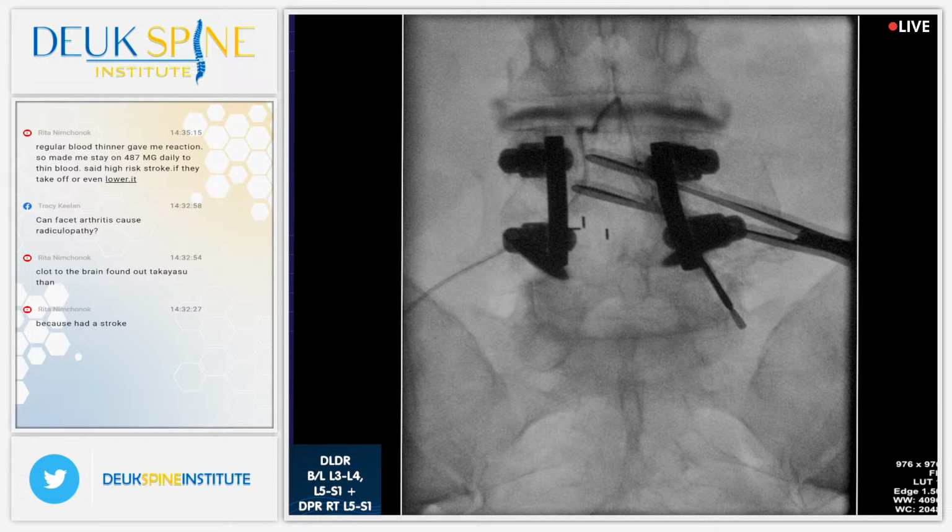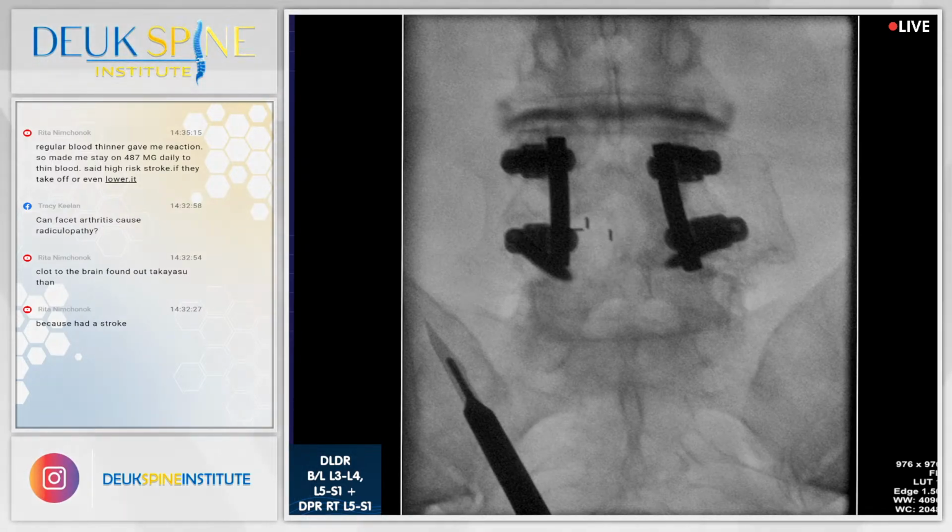So if I can get my probe right there, we can kill the pain nerve. It doesn't matter where you come from, what continent, what sex you are. Shot. None of that matters. In the end, the fix is the same for everybody.